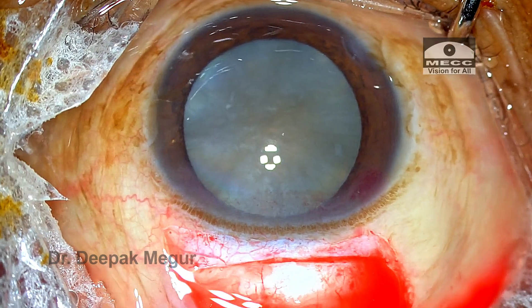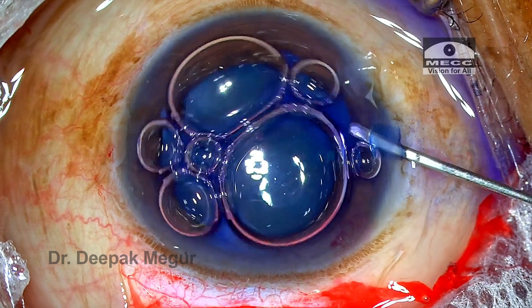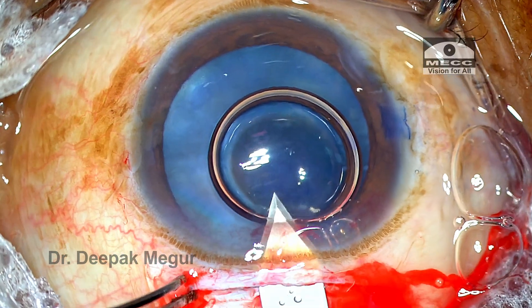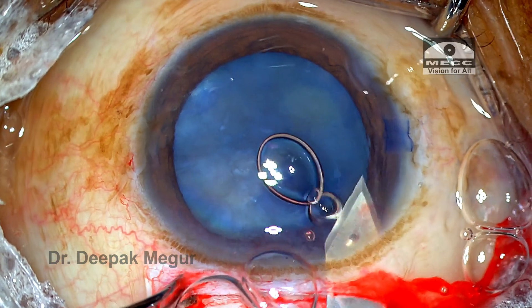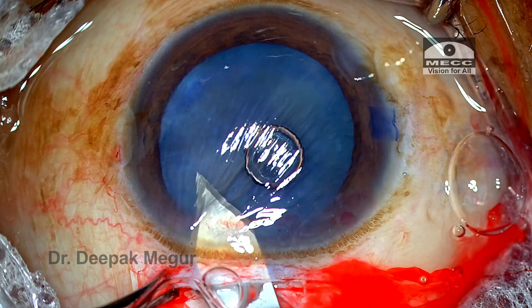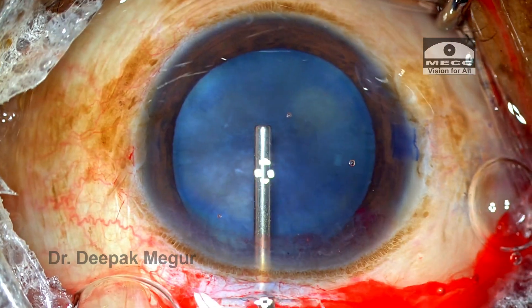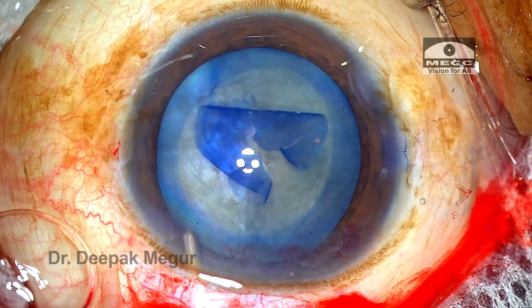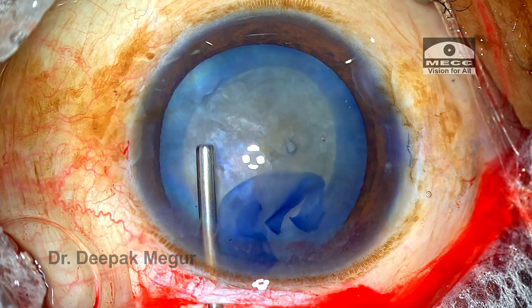The scleral tunnel is created — it's a relatively large scleral tunnel, about 7.5 mm in width. The side ports are made, the capsule is stained, and the chamber is entered using a sharp 2.8 mm keratome through the main incision, then extended laterally to fashion the internal lip of the wound. Capsulorhexis is performed and is of adequate size — about 5.5 mm circular.